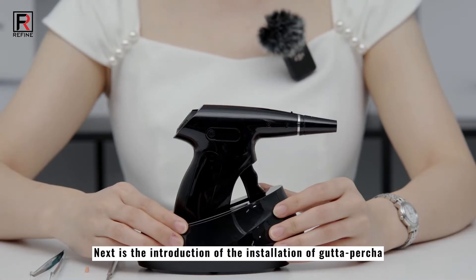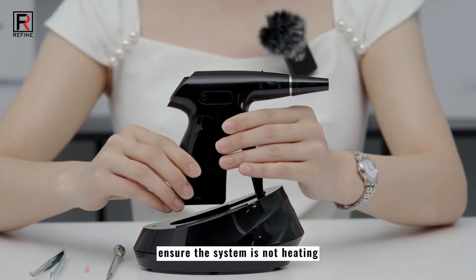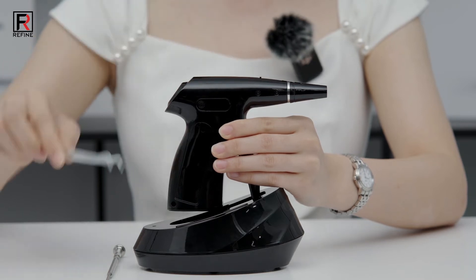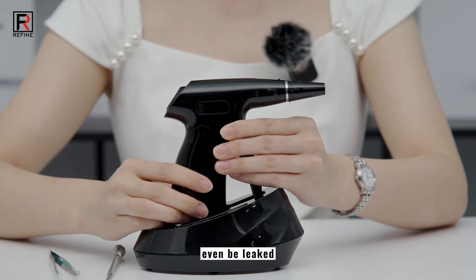Next is the introduction of the installation of gutta percha. First, open the hatch. Ensure the system is not heating. Pick up the gutta percha with tweezers, then close the hatch. If the system is heating, the gutta percha could be melted or even leaked.